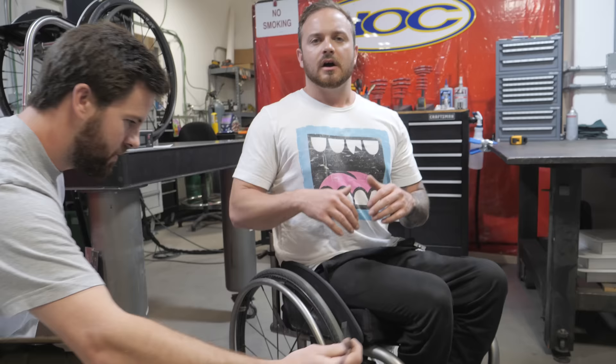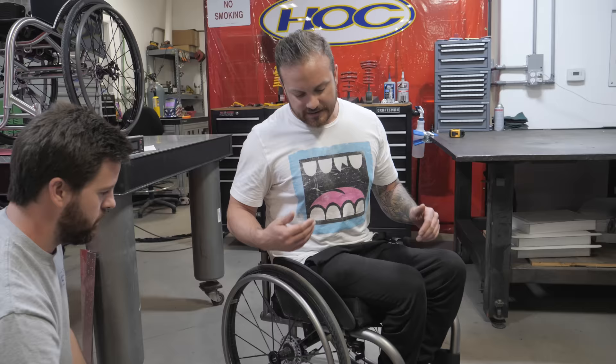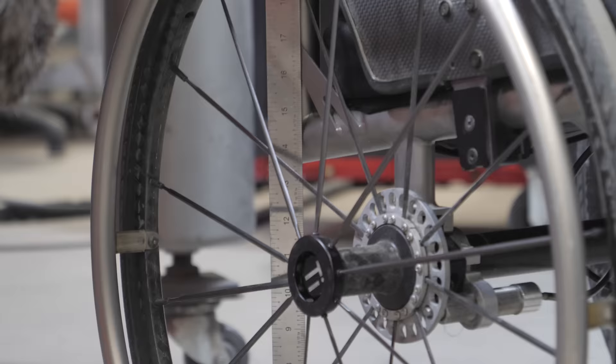Now they're going to take some basic measurements, throw me in a couple of different chairs and see if I can get a feel for what I really like. So Eric is taking a few measurements that are going to quantify into what is called the dump or the seat bucket — it's the difference between the height of the front and back point over the distance of the wheelchair. Usually people with a higher level of injury that have less core strength prefer a deeper bucket so they can be more wedged in the chair and have more balance.